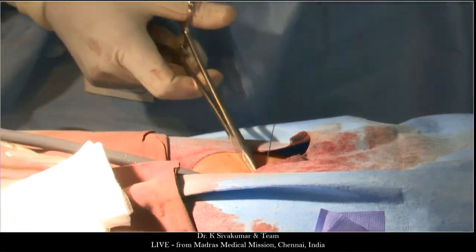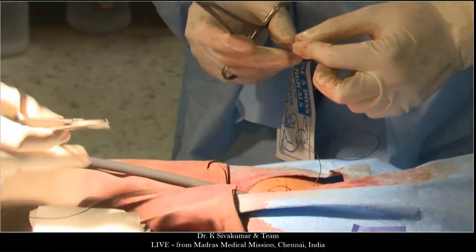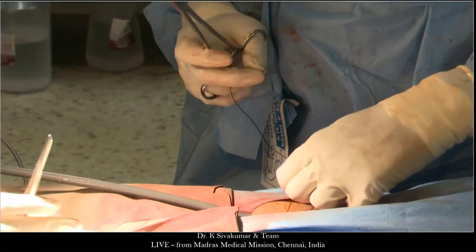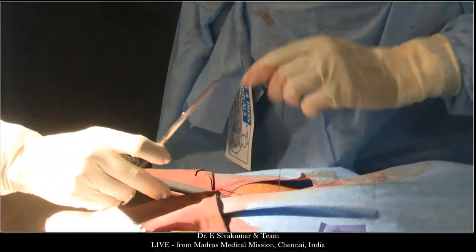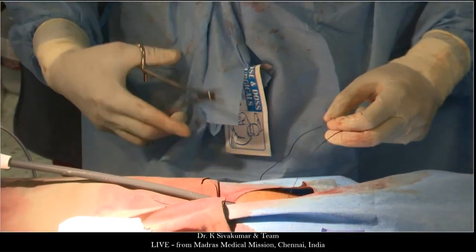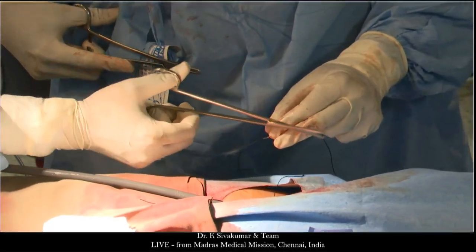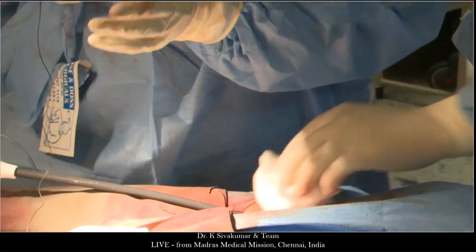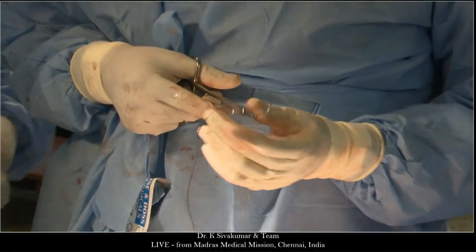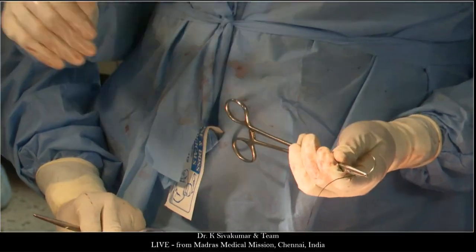I heard the question partially. Is it about the pulmonary vein getting occluded? The question is on the higher pulmonary vein. Have you had cases where there is some stenosis and decrease of flow that you had to go back and dilate the strut into it? No, not at all. So far, no. Actually, in all the cases, what we do is we mount an uncovered stent on the top and then a covered stent on the bottom.